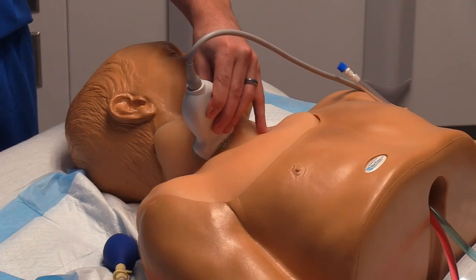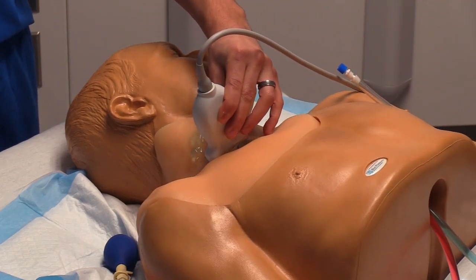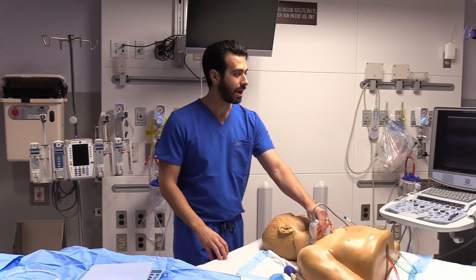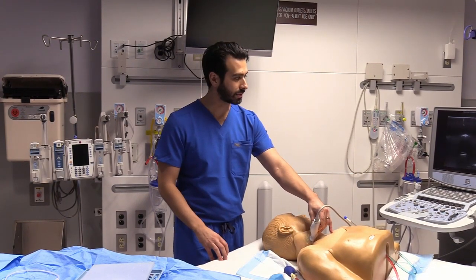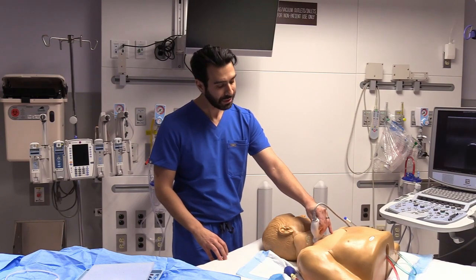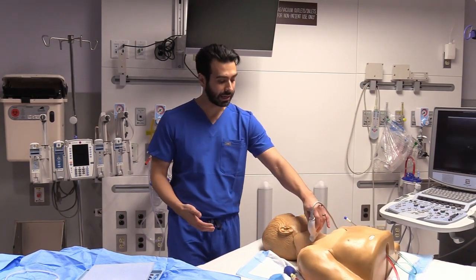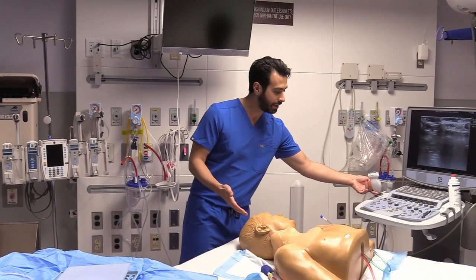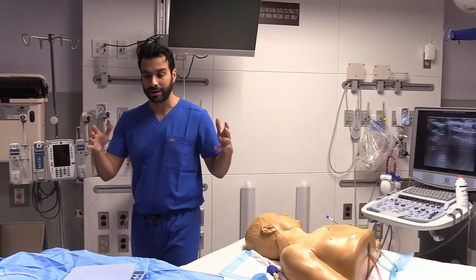So I usually start here and then progress approximately all the way to the clavicle, and then make sure that the IJ is open the whole way, that there's no narrowing, and that there's not going to be any stenosis proximally that's going to cause a problem for the patient. So once I've verified my site and I know that this is where I'm going to go, the access looks reasonable, the vein looks like it's open, then I would get ready with my equipment.